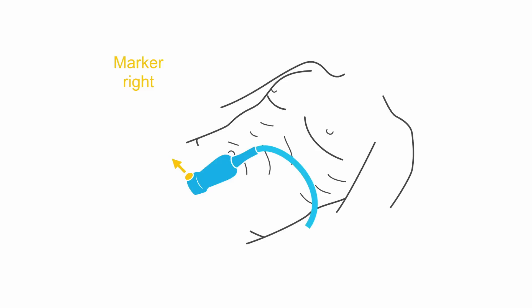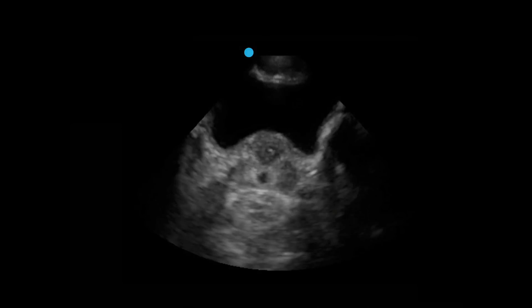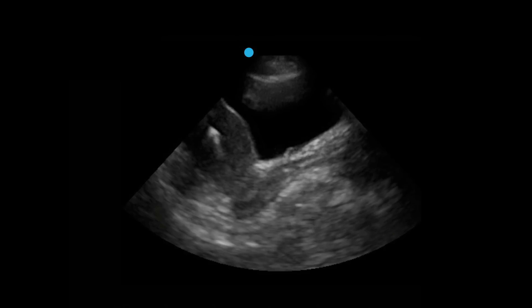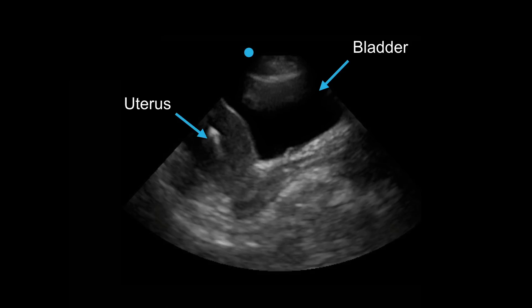When performing a renal study, you also need to obtain a short and long axis view of your bladder. To obtain your bladder in short axis, place your phased array probe low on your patient's pelvis. You will often be able to identify some pelvic organs like the prostate seen here. You then want to flip your probe to have your indicator towards your patient's head and identify the bladder in long axis. Here you can also identify the uterus posterior to it.